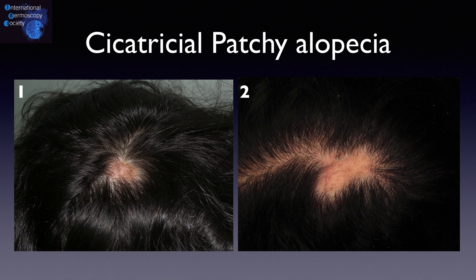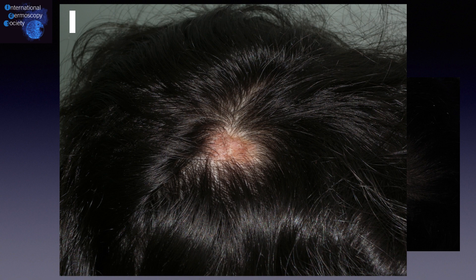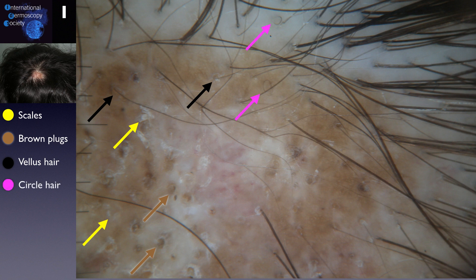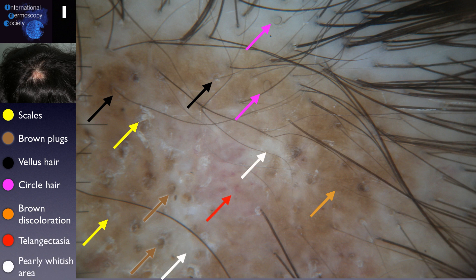Now we have two cases of cicatricial patch alopecia. In the first case, we have erythema and discoloration on physical examination. Dry tricoscopy is very important here and presents with scales in the affected area, brown keratotic plugs, vellus hairs in the periphery of the patch, circle hairs — which are very commonly seen in this disease — scattered brown discoloration of the skin, some telangiectasias, and pearly whitish areas in the center.